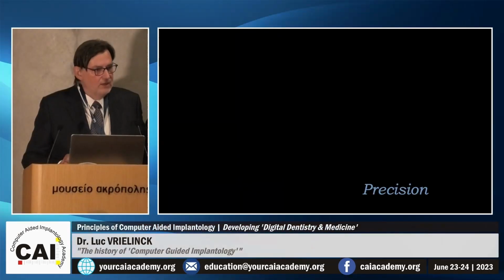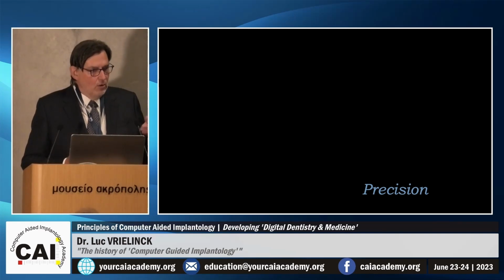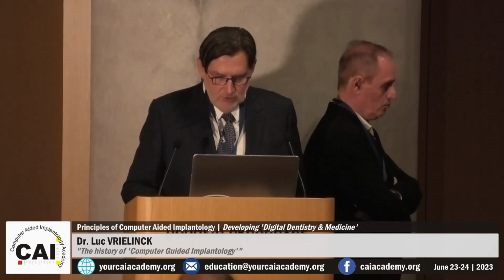Then the planning has to be transferred. We have talked about drill guides, we have navigation, we have computer. All those means are developed to increase the precision of the operation. Remember, accuracy and precision are not the same, they are two different things. But now we are talking about technical things. This is precision. This will improve.